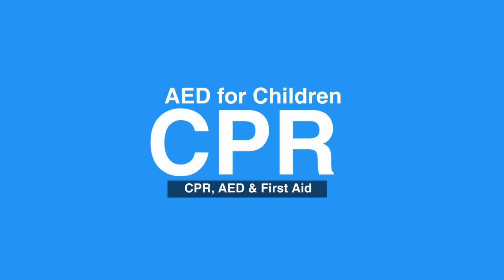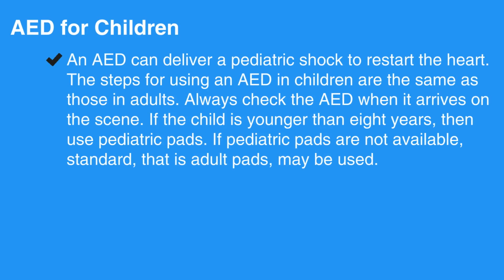Welcome to the lesson on AED for children. In this video, we will discuss AED use in children and go over step-by-step directions to use it. An AED can deliver a pediatric shock to restart the heart. The steps for using an AED in children are the same as those in adults.